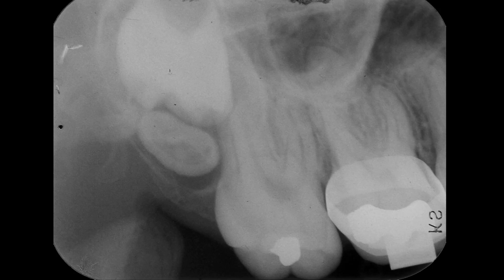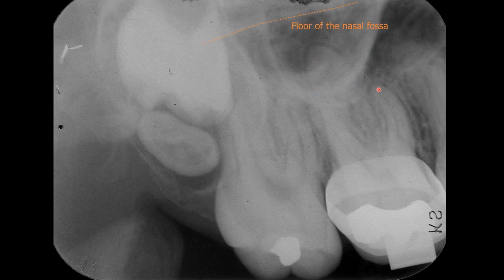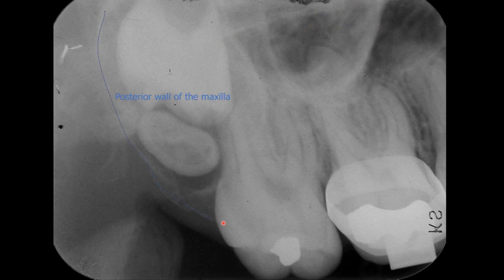Let's review a few anatomic landmarks on this radiograph. This line represents the floor of the maxillary sinus. Here is the zygomatic process of the maxilla. Further superiorly, we see a radiopaque line, and this line is the floor of the nasal fossa. Here, we have a corticated line, and this would be the posterior wall of the maxilla.